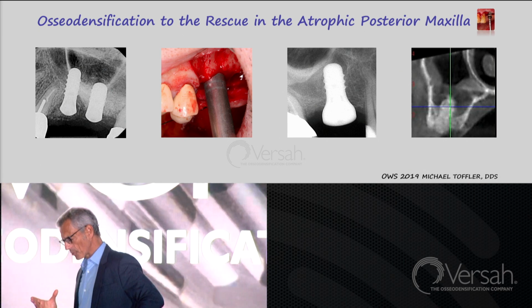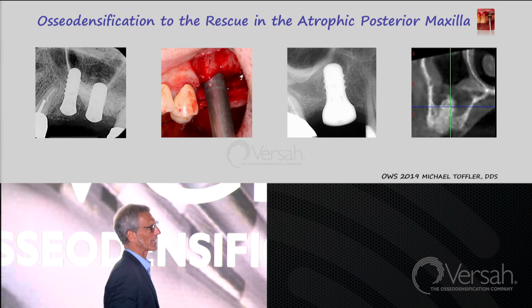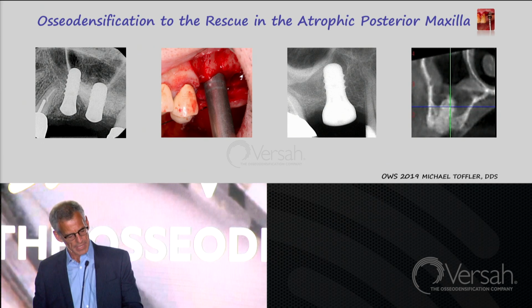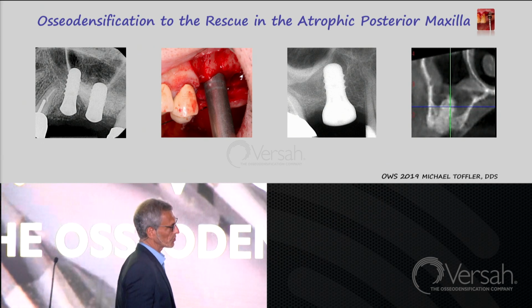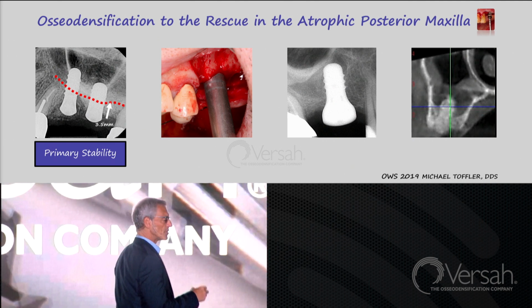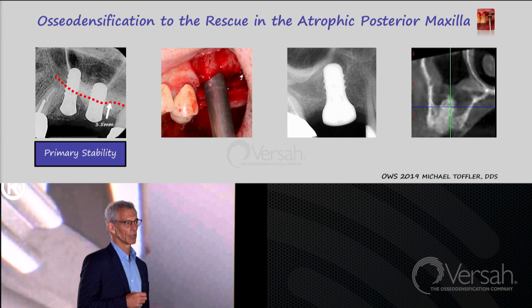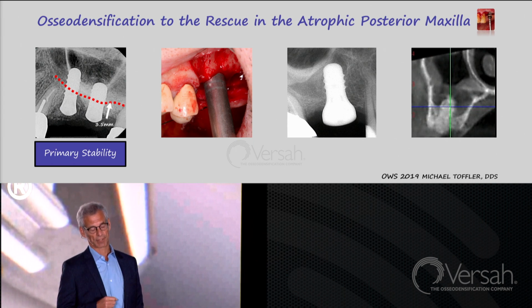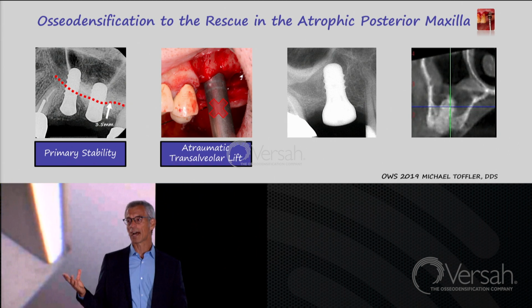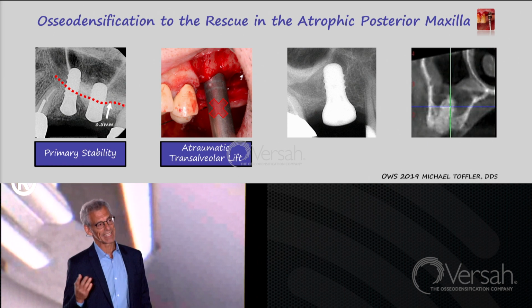Today, I'm going to share with you how osseodensification has most significantly impacted my sinus lift procedures. In dealing with an area of reduced bone density and reduced subantral bone volume, there is no overstating the value of primary implant stability or any means to increase it. Now, I was born with an osteotome in my hand, and now I have cut down my use by 80 to 90%.